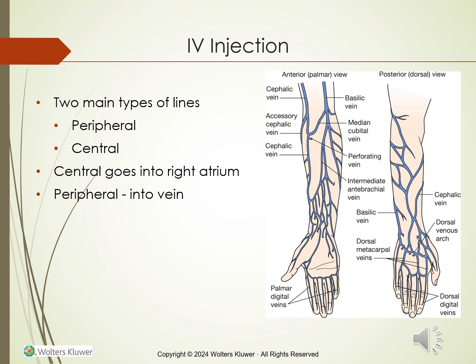Choosing the right vein for venipuncture is crucial and depends on the type of contrast that is being used, the infusion time, and the patient's condition. Veins in the hands and arms are preferred over those in the lower extremities to reduce the risk of embolism. You want to avoid veins over joints or the palm side of the wrist due to potential needle dislodgement or pain to the patient. Small veins should be avoided to prevent leakage as well as pain.